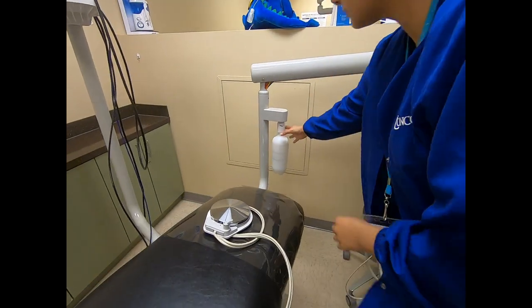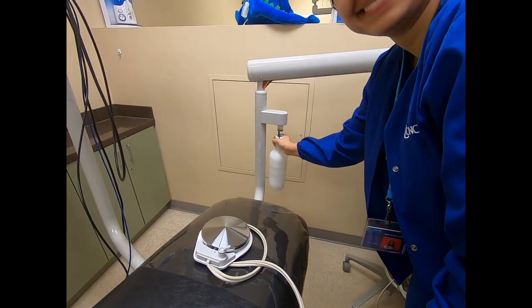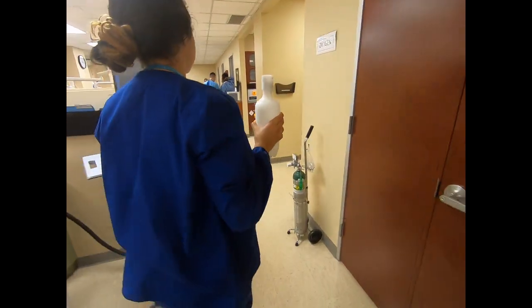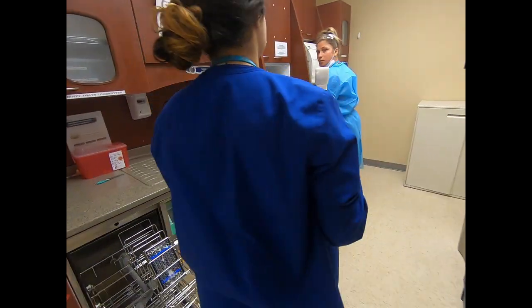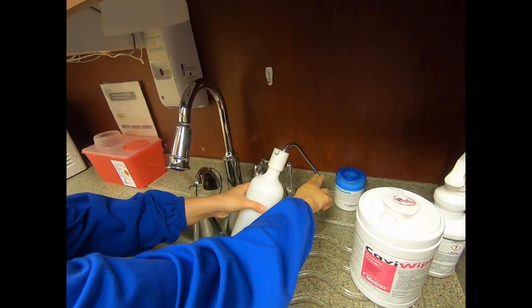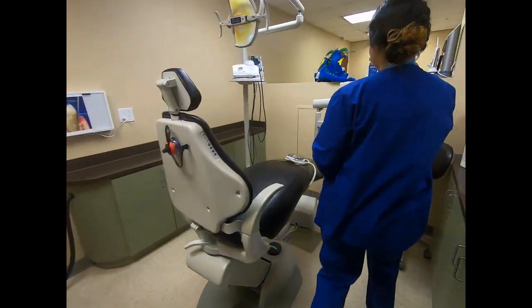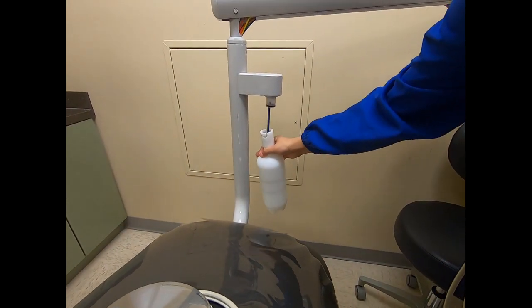Once your hands are clean and dry, enter the operatory and remove the water bottle with clean hands. Avoid touching and contaminating the blue tubing. Fill the water bottle with distilled water and return to the unit to reattach the bottle. And again, do not contaminate the blue tubing.